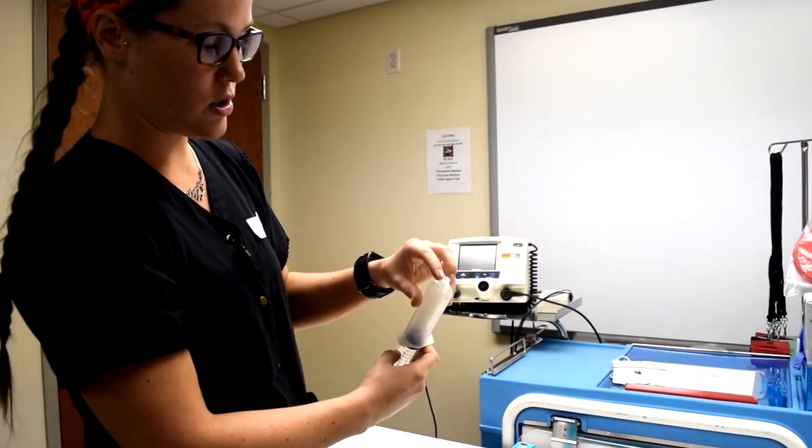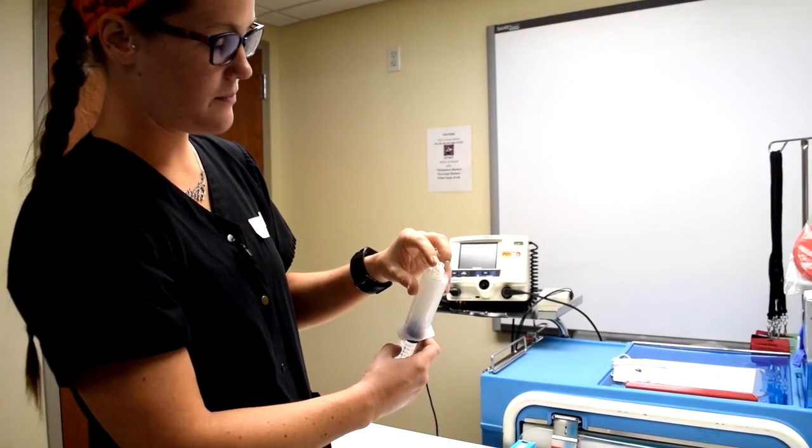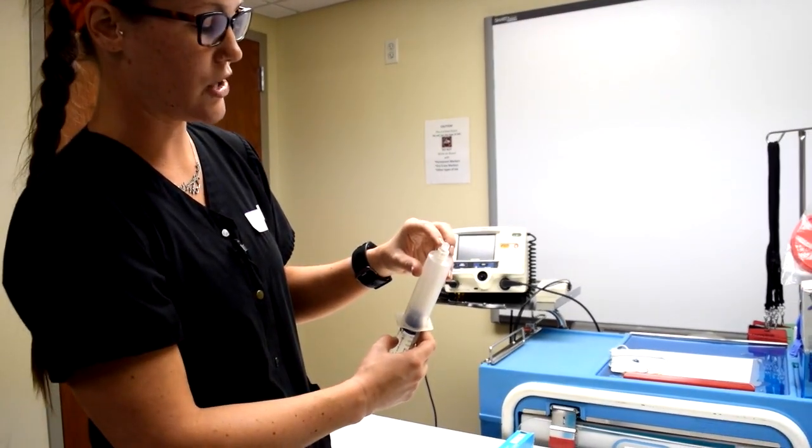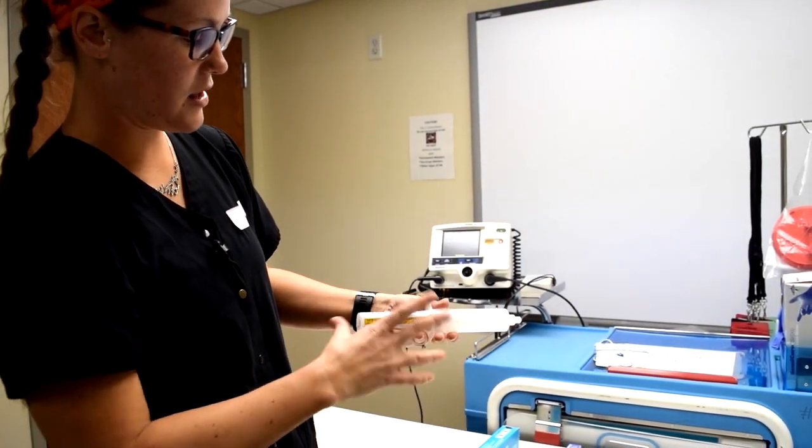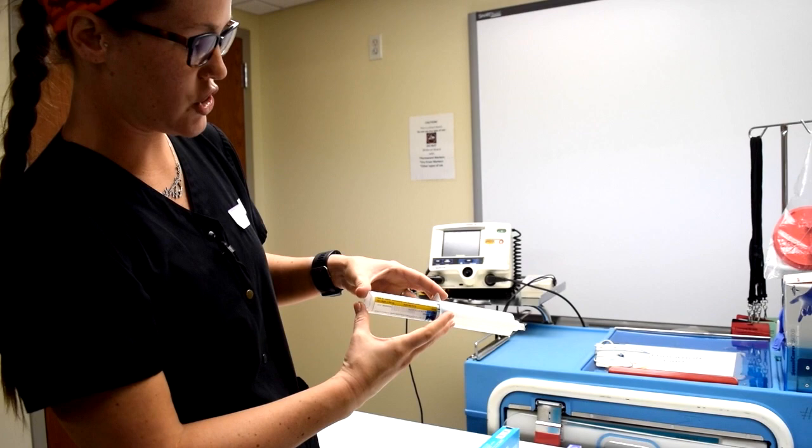Now at the top here, you'll see your luer lock or your needleless connector right there. So whenever you get ready to administer this medication, you'll go ahead and twist it on, make sure that you're on securely, and then you'll use these wings and inject the medication.